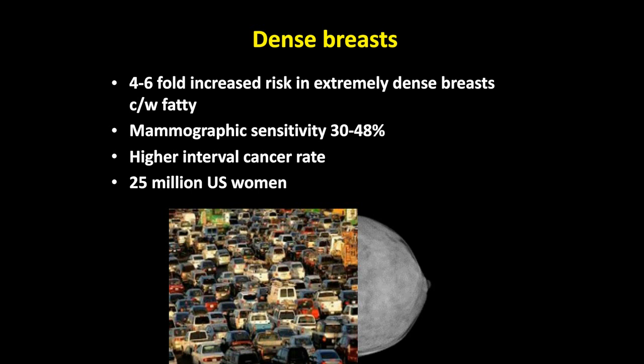First of all, women with extremely dense breasts have a 4 to 6-fold increased risk of developing breast cancer compared to women with fatty breasts. Most important, however, is that the density of the breast tissue masks cancers, and that's why the sensitivity goes way down. These women have a higher interval cancer rate, often presenting with larger tumors. And I like to show a dense breast in relationship to a freeway in Los Angeles, where if you're trying to pick out that one red car, it's really hard to find.